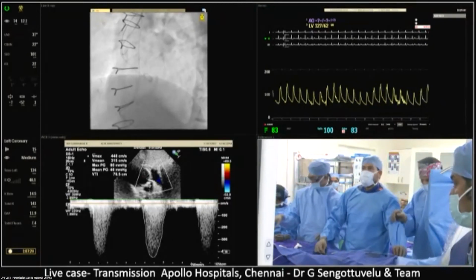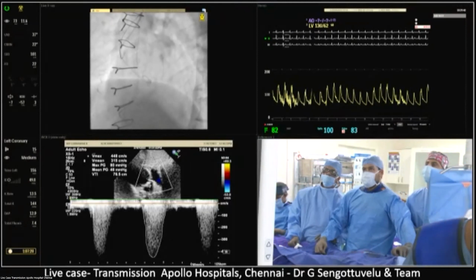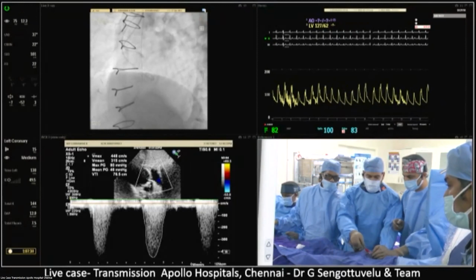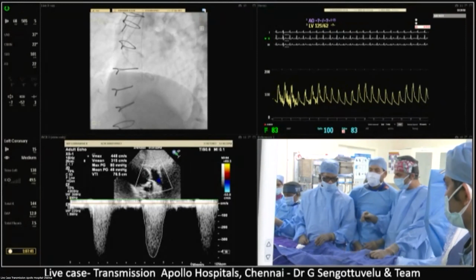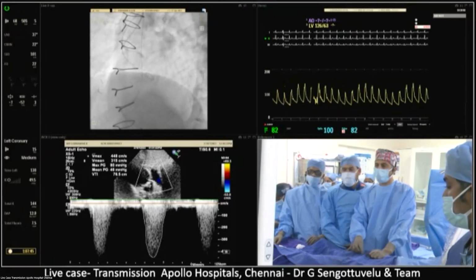So they have the Accurate Prime, which is their next iteration, significantly improves radial strength, and I think will address some of these issues. But until then, I think pre-dilatation and possibly post-dilatation in this type of anatomy especially is going to be necessary. Yeah, absolutely. And more aggressive pre-dilatation, unlike the pre-dilatations we do for the other valves, we go with a minor diameter. We have to be more aggressive.